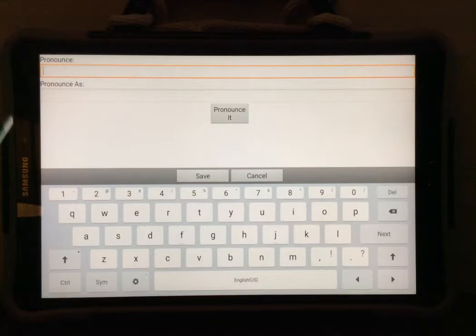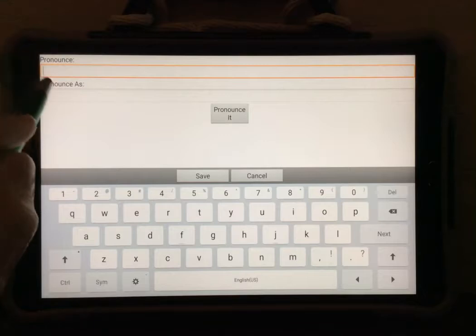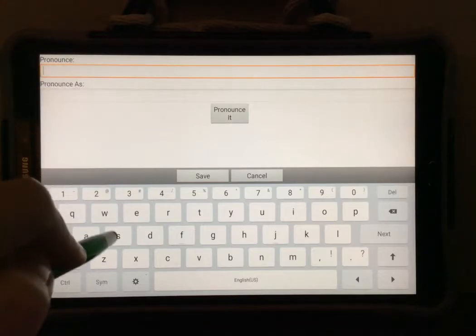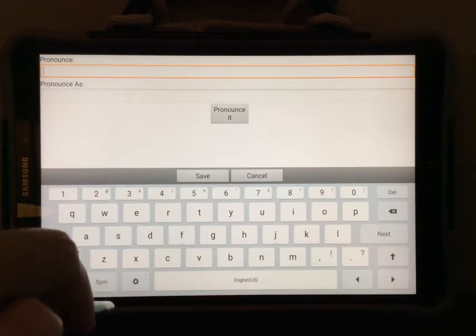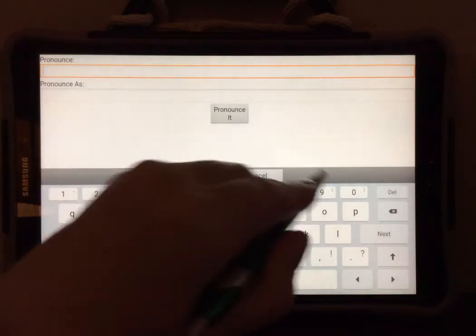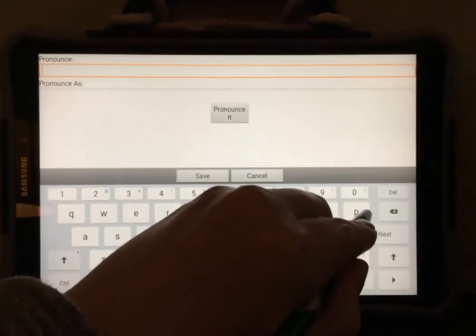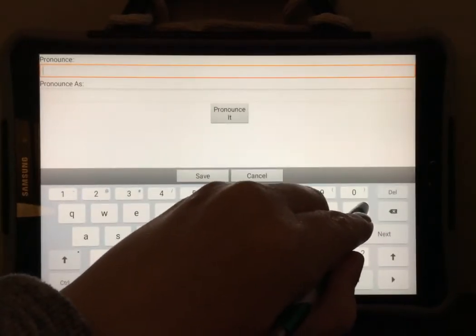Type in the word correctly first. So spell the word the way that it is supposed to be spelled. I'm going to type in presence.